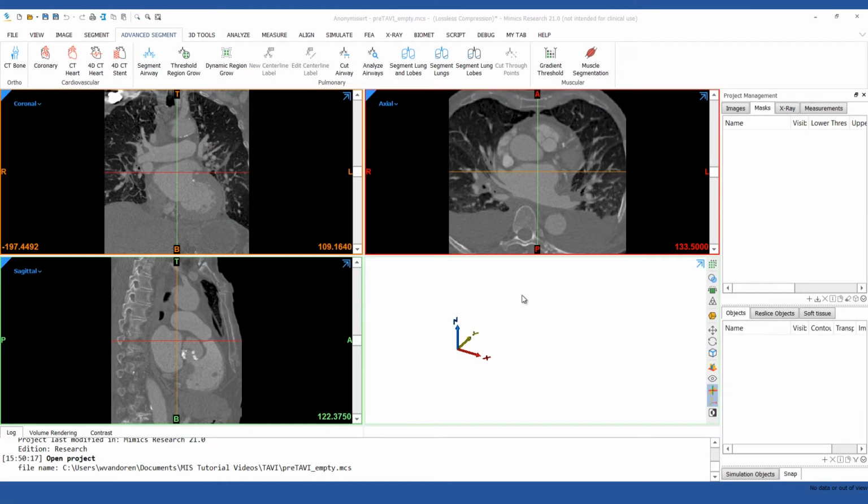Hello, I'm Inês, and I'm an application engineering team leader at Materialise. In this video, I will show you how to assess the aortic valve to plan for a TAVI procedure.